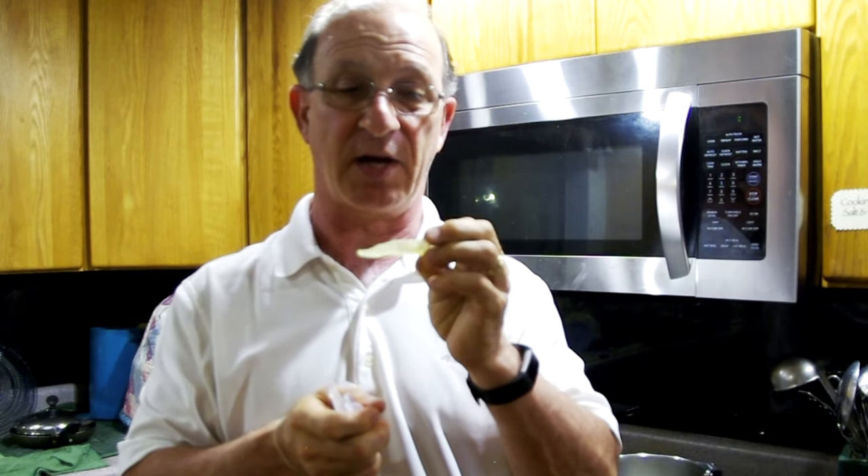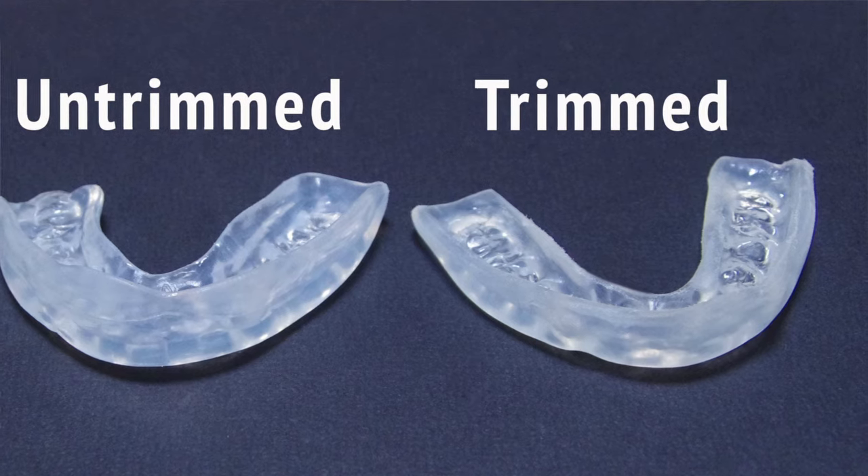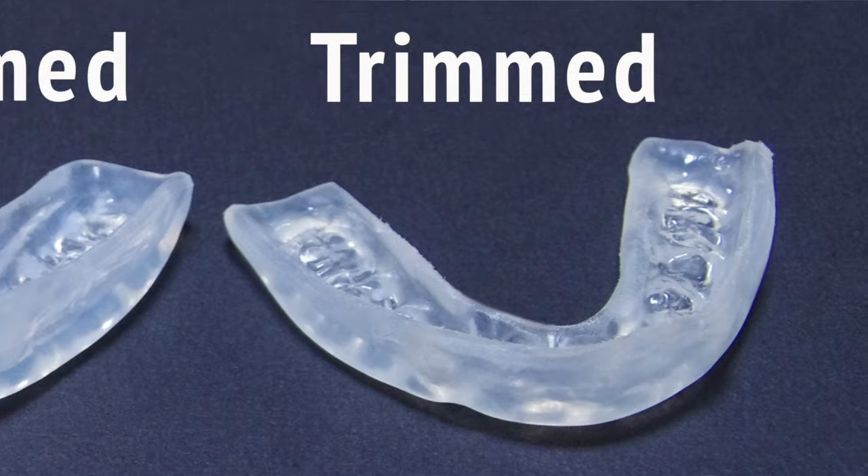This is my old mouth guard, this is the pre-trim one, and this is the final trimmed one. I soak these mouth guards in alcohol every night, but they do turn yellow over time — that's when you know it's time to replace them. The pre-trimmed one makes it very difficult to talk, while the trimmed one is much easier. It still is a little bit hard, but it stays on my teeth and it'll protect my teeth at night.